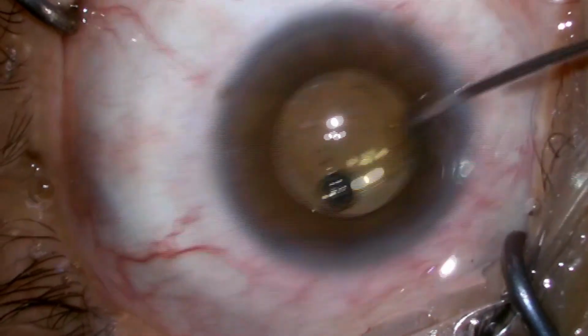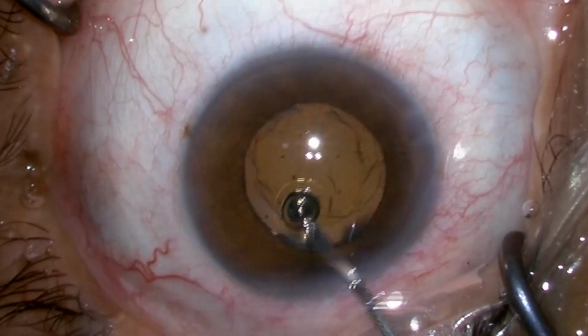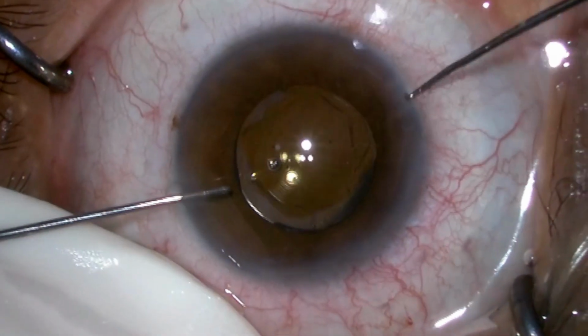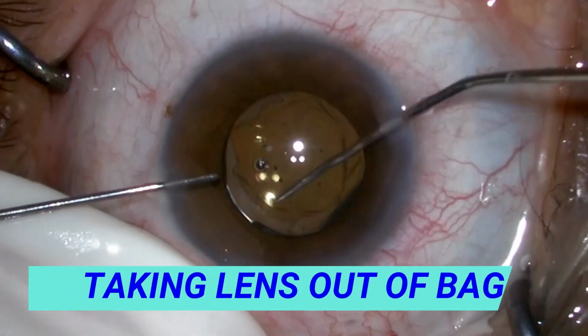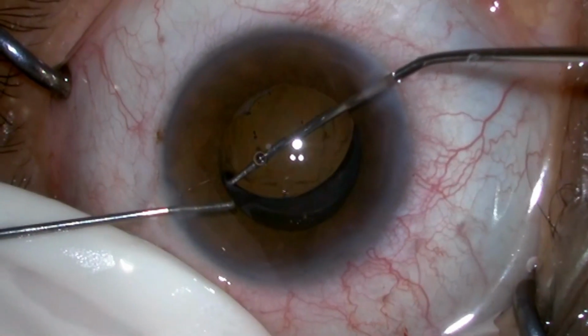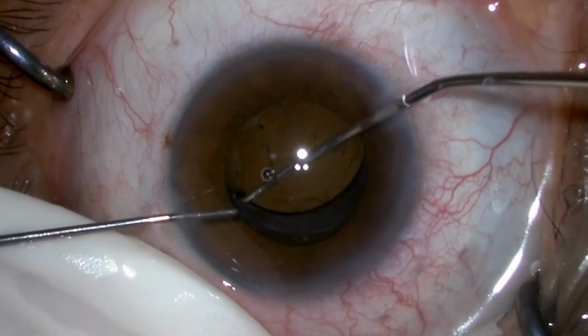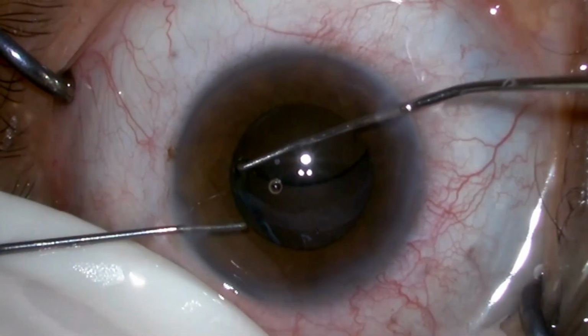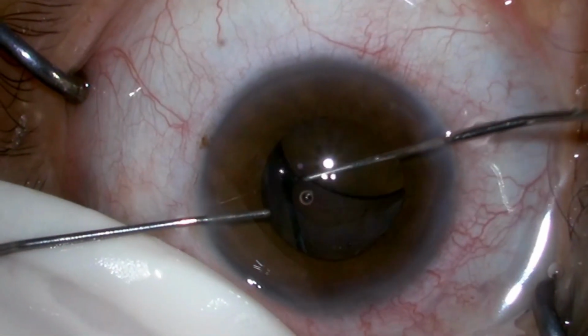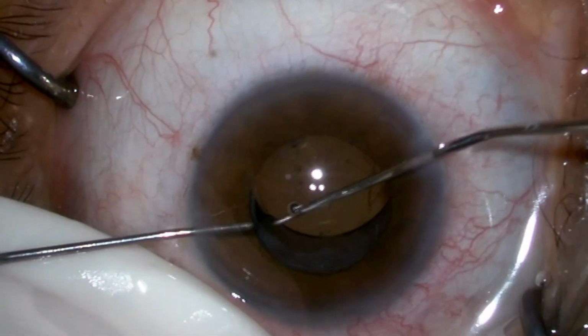Now we are trying to take the lens out of the bag. As the case is pretty old, 2 years old, this haptic is pretty much adherent and difficult to take out.